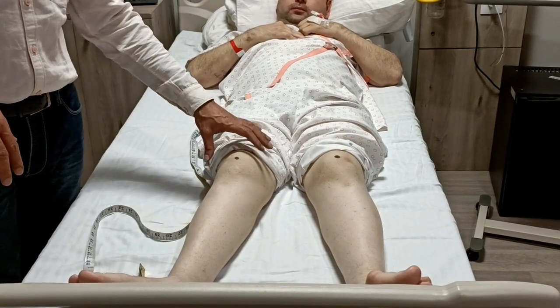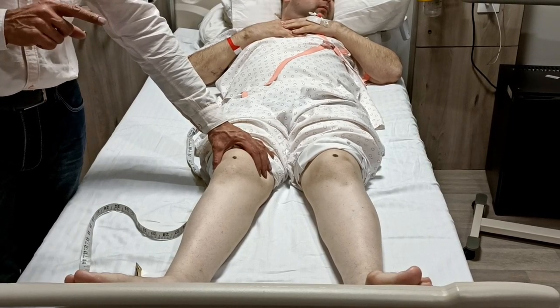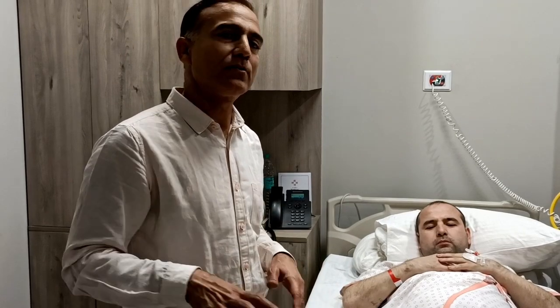We have taken his CT scan to see the picture of his tibia and femur and we have calculated all the cuts with our software. So when we do a robotic surgery, we feed the same information into the robotic computer and the robot will cut the bone accordingly. We not only make sure that every cut is precise — we have to see the depth of the cut, the angle of the cut, the inclination of the implant — so that we give him the best result. That is the advantage of robotic surgery.